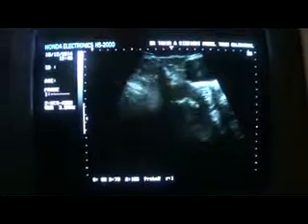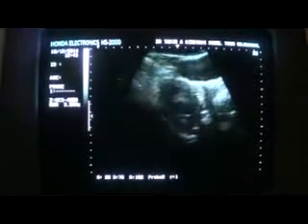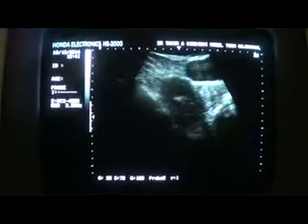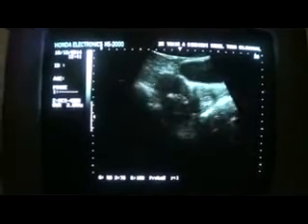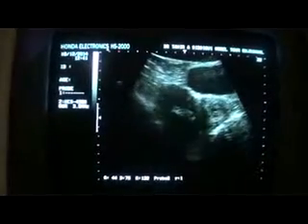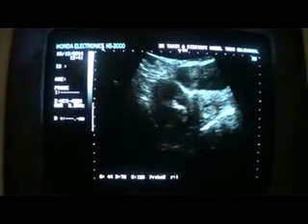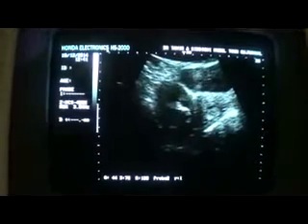Picture. This is a pelvic ultrasound of a young female with the history of primary infertility for the last 16 years. This is the uterus in front of you in longitudinal section. Well, this is the cervix, and this is the anterior myometrium.